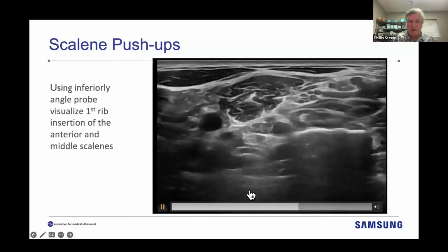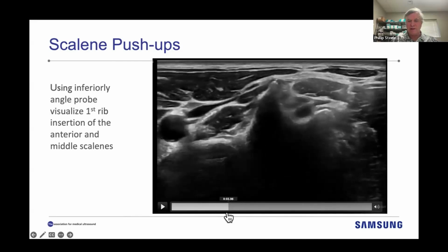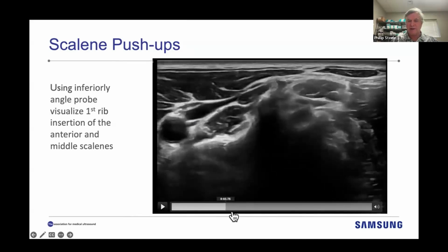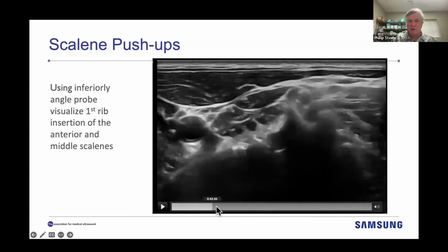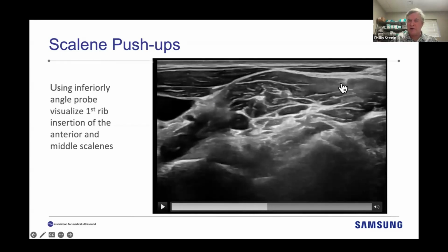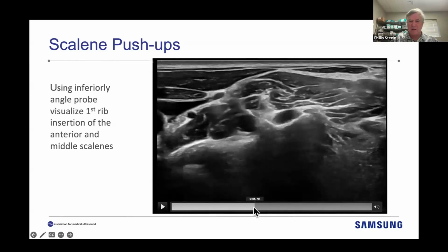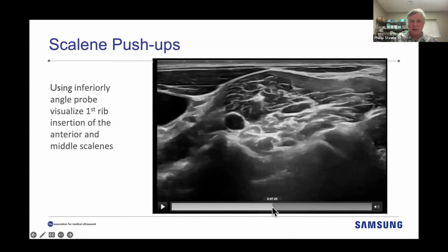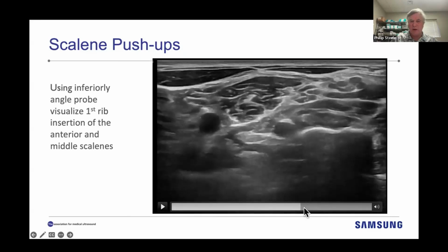This is an interesting case that I saw recently. This is C6, a very abnormal looking, weird C6. This is C5 coming out right here. We're going to go C6 and 7. Look how elongated the nerves are through this tissue plane. This has a very interesting C7. You can see this is C7. You look at the anterior tubercle here, and the posterior tubercle looks quite variable. And then this is C8. And then you can see T1 right here popping out.